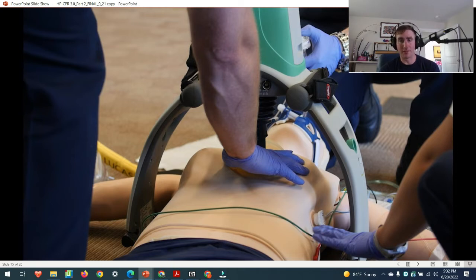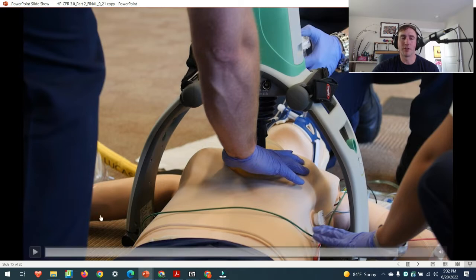And then a few years later, they decided, we'll try it again. And then they trained everybody. They spent a lot of time, effort, and money training everybody how to use the Lucas device. And then their survival rates didn't improve, and they saw a lot of long pauses, so then they had to take them off the trucks, do retraining, and then put them back on the trucks. So it's a big process to implement mechanical CPR devices efficiently, at least.